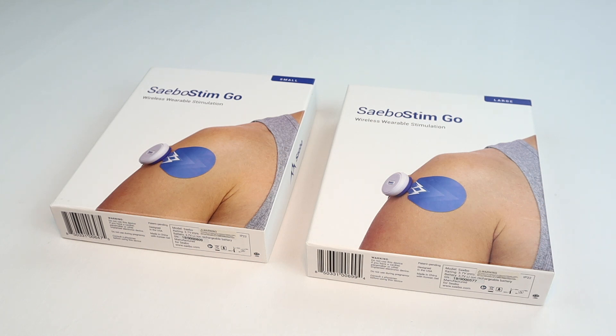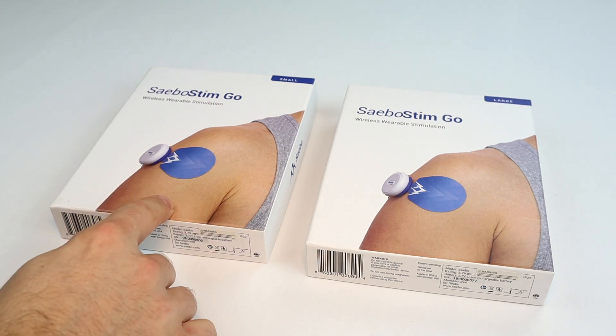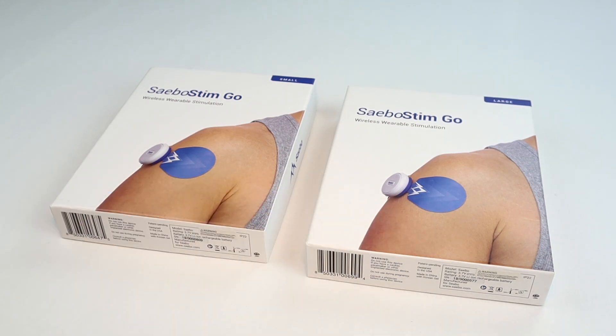So if you're ready to strengthen your muscles and improve your movement, let's open the box and talk about what's inside. Here you can see two boxes of the SableStim Go. It comes in two sizes, a small and a large. You have to do one measurement to figure out which one is best for you.